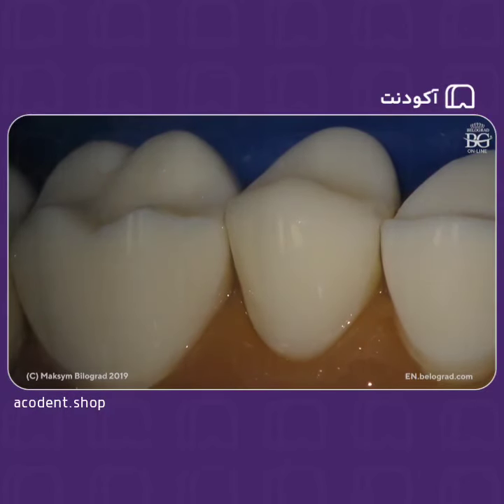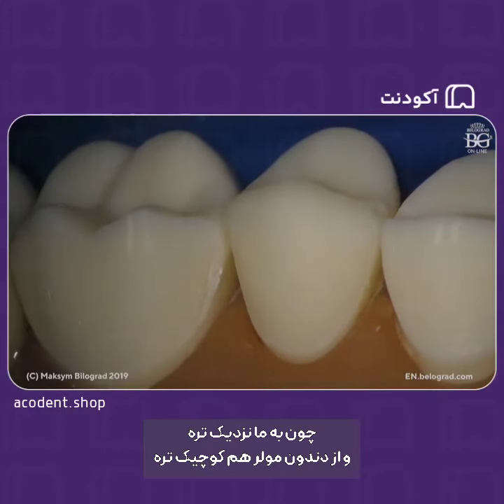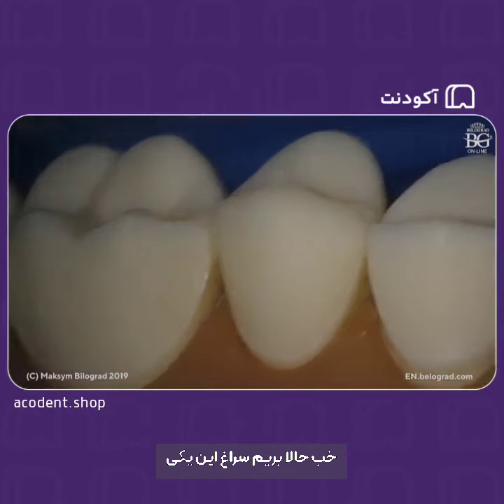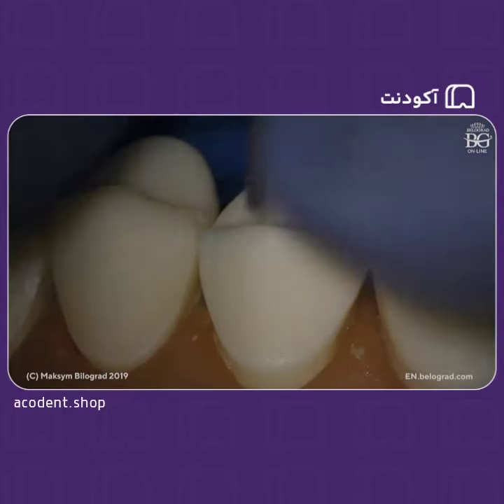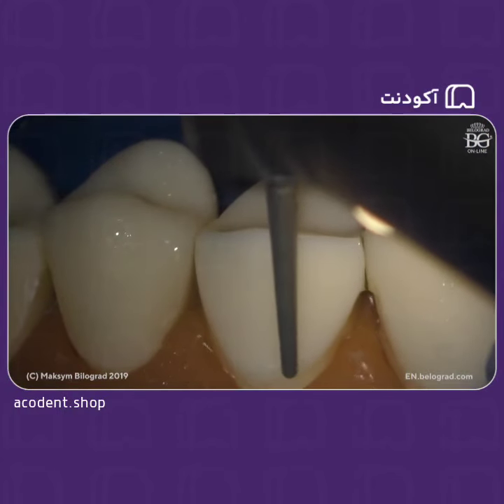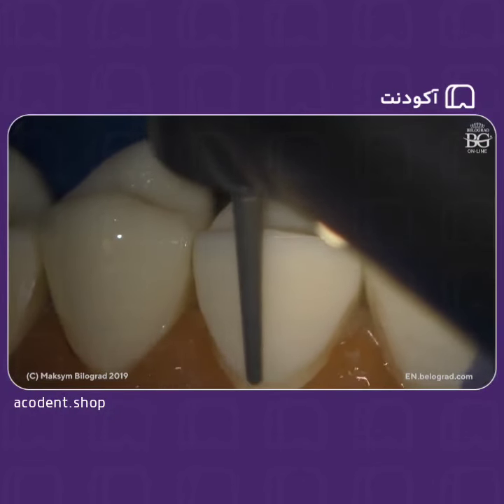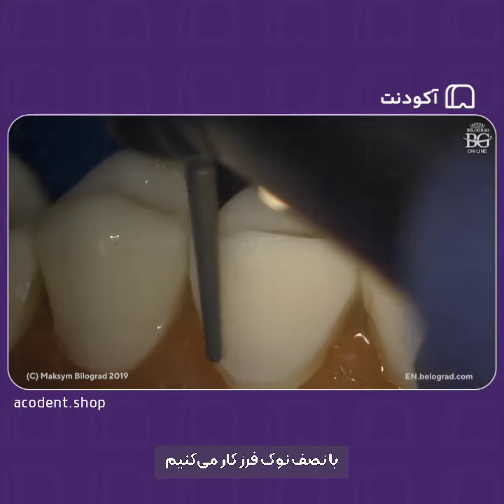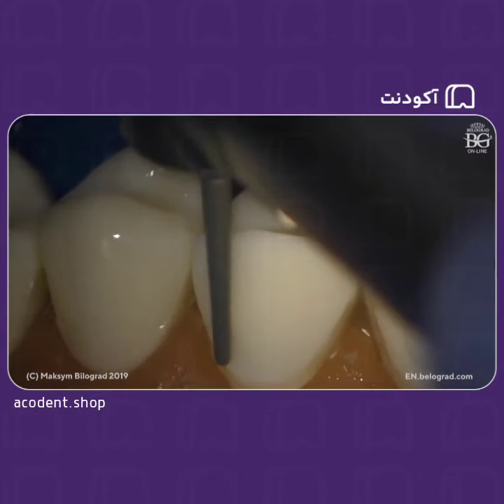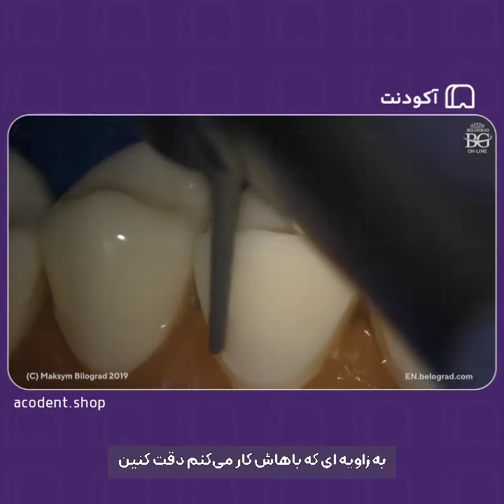Okay, it's done. Premolar is easier because it is closer to us, and also it is smaller than the molar tooth. And now let's go to this one. Same thing, we will move our finish line more down. We move finish line more down, working with a half of the burr, half tip, moving preparations more distal. Pay attention to the angle that I'm using now, see?